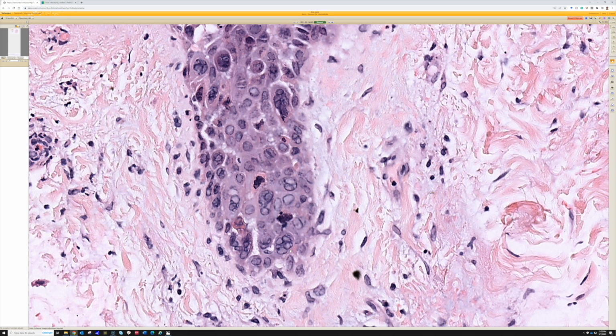And the only way to definitively know that is by doing an immunostain or PCR to tell apart simplex and zoster. The cytopathic change looks the same for both of them, at least to my eye. Obviously, the clinical presentation usually can help you quite a bit. If it's spreading along a dermatome, then it's zoster, right? Almost certainly. Or if it's a lesion on the lips or on the genitals, it's more likely simplex.